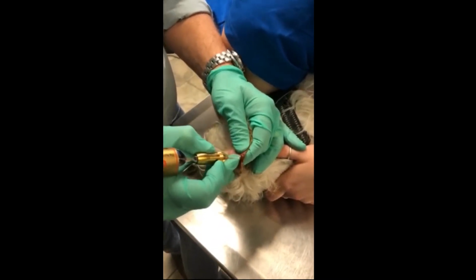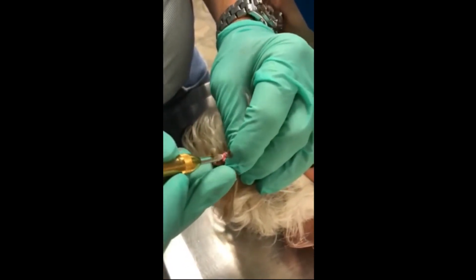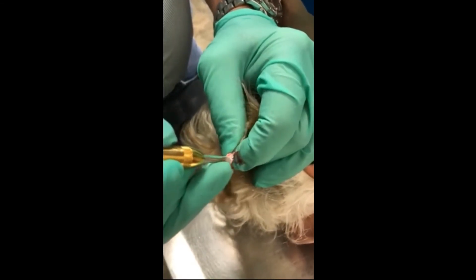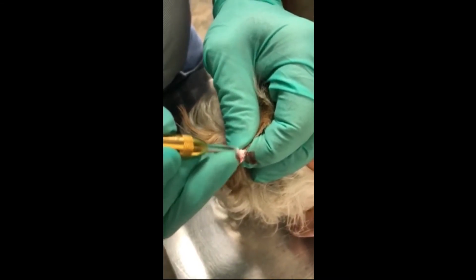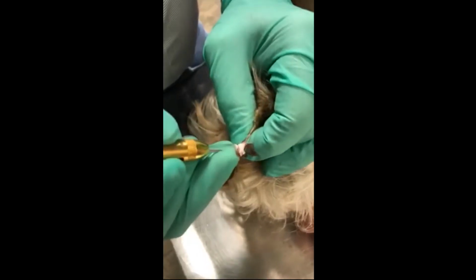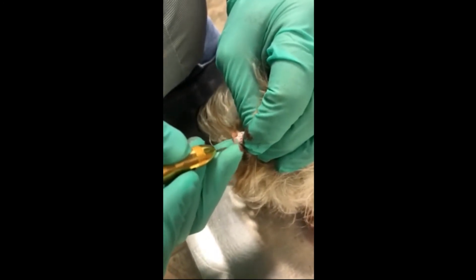So following a thaw cycle, we're going to go ahead and refreeze. We're looking for the most rapid freeze that we can get directly on the tissue, as that creates the greatest damage on a cellular level. Because this is on an ear margin and centrifugal force tends to cause them to bleed, I have recommended that clients either use an Elizabethan collar, which the dogs hate, or alternatively a knee sock inverted over the head to keep the ear that's been treated flat against the cranium.